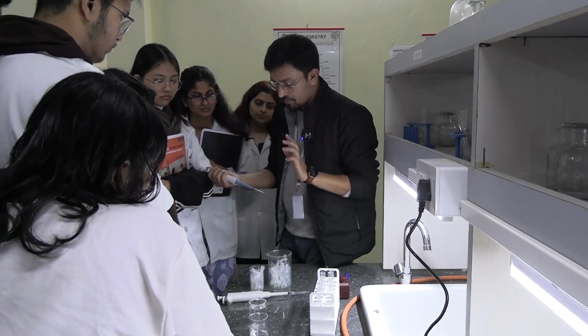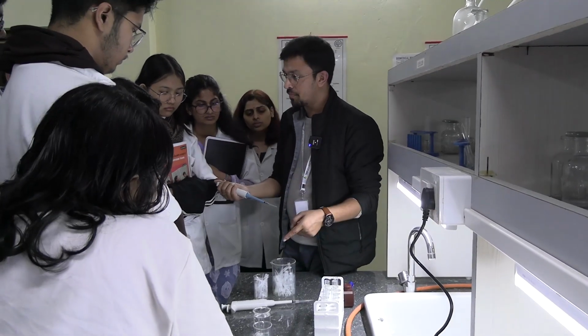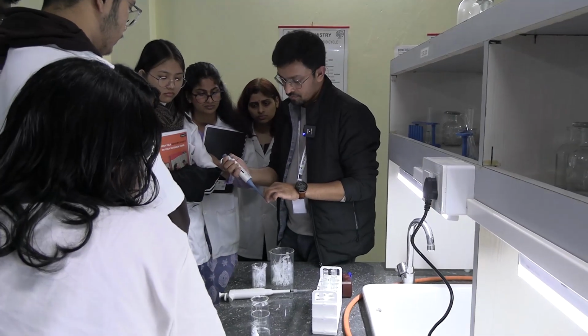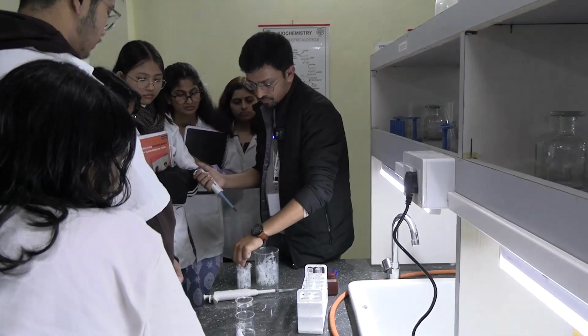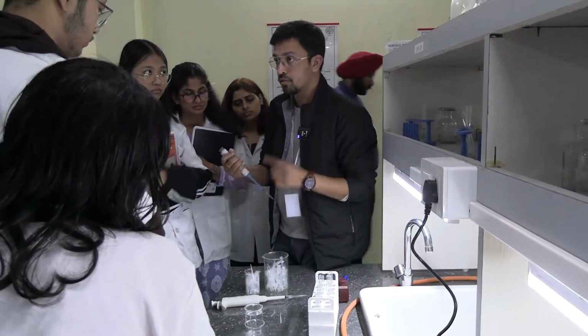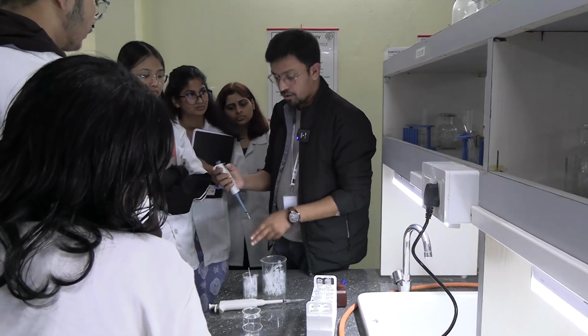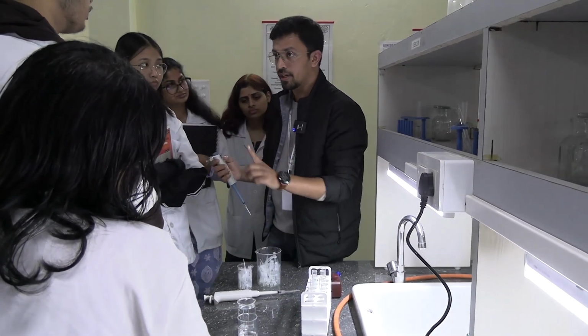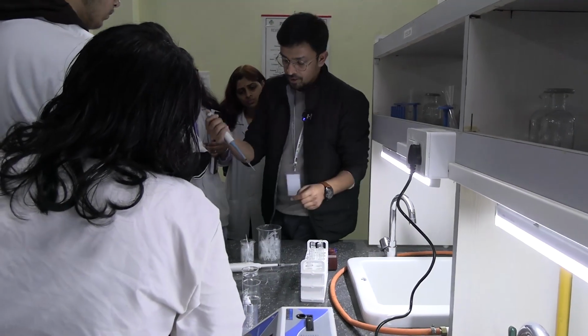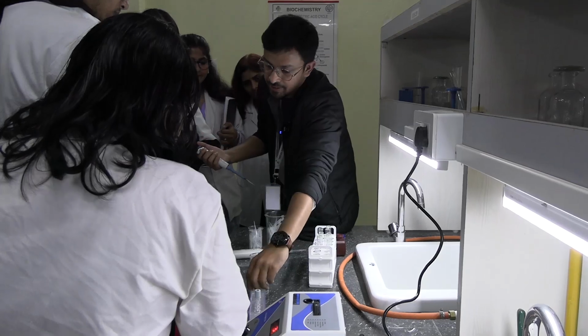Okay, now basically what you have to do, you have to use another tip for the standard, another tip for the test. But if you are using only one tip in the exam, let's say you are not provided 3 tips, you have been given only one tip. First always take the blank so that the mixture does not happen. Okay, after that what we will take? We will take the standard. This is the standard.